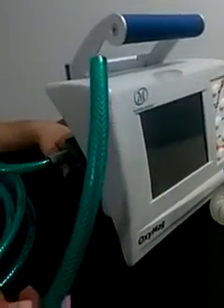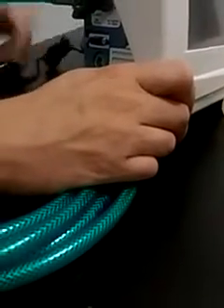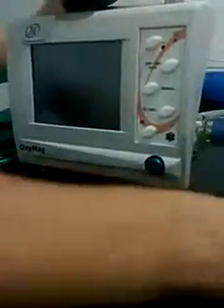Then you supply the equipment with oxygen. You connect the hose from one side, and the other side you connect to the cylinder with regulator, of course, or a pipeline. And of course, if you want to connect the AC power, then you connect first the inverter, and here you connect the AC cable. Right now we are going to use the battery. Now the equipment is ready to connect to your patient and use.